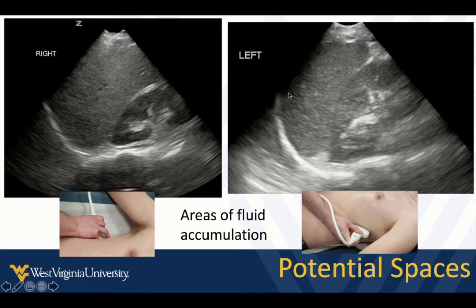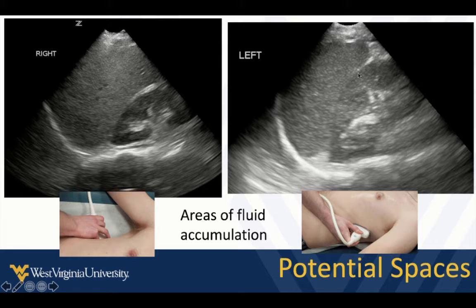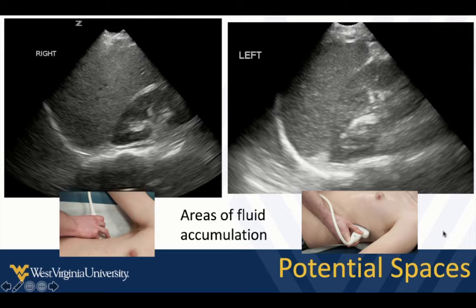On the left side, the sub-diaphragmatic area is more important because you're more likely to see fluid accumulate here. There is a splenorenal ligament that generally prevents fluid from getting between these two organs. So our potential spaces are sub-diaphragmatic and up around in here — there's kidney, there's spleen. These are some of the first areas to look for fluid accumulation in the peritoneal space.